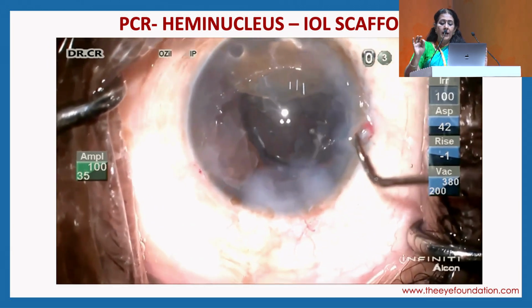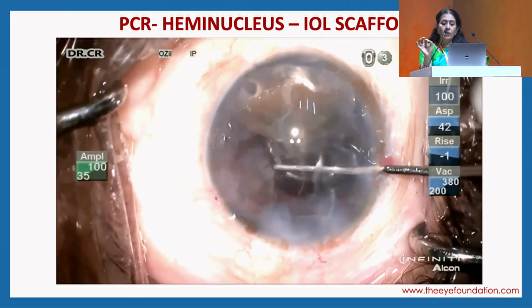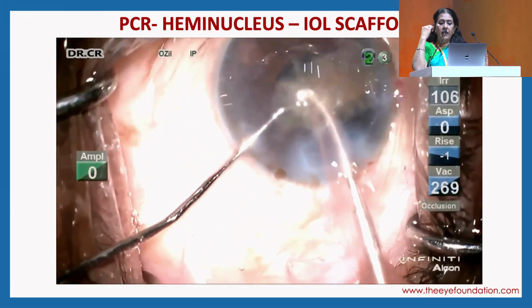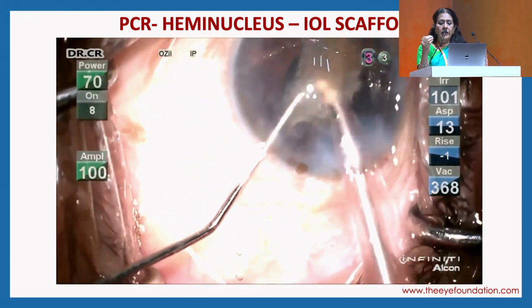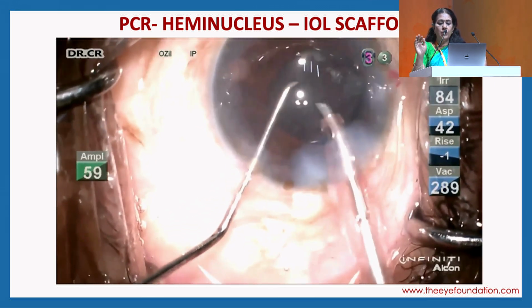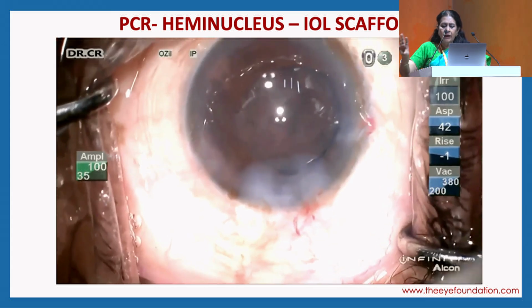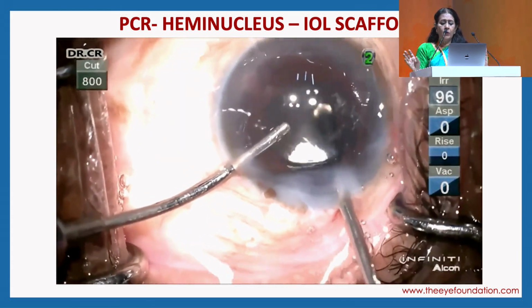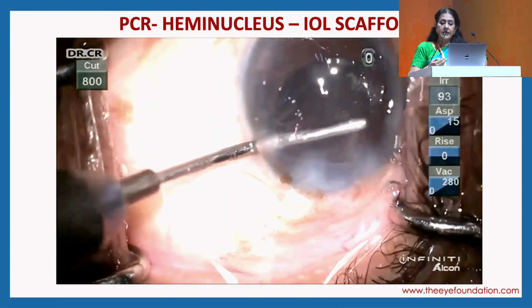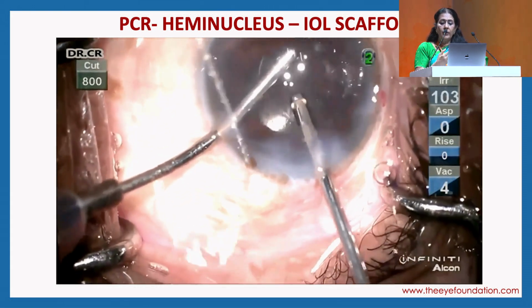Now here, the vitreous disturbance is not adequate, so I'm able to visualize the area of the sulcus, and I'm positioning the haptic onto the sulcus right away at one go, and then I deepen the anterior chamber and give enough coating of the corneal endothelium with viscoelastic, and very gently, carefully, repeatedly injecting viscoelastic, I get the errant nucleus out, and then I do a vitrectomy behind the IOL, and of course I see there's vitreous in front, and then do a vitrectomy in front.